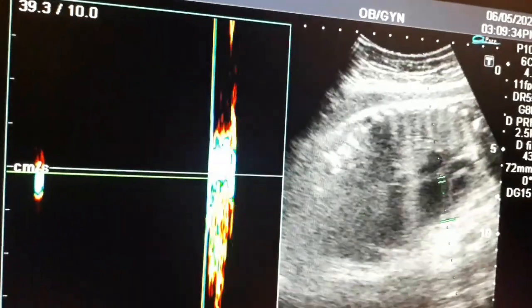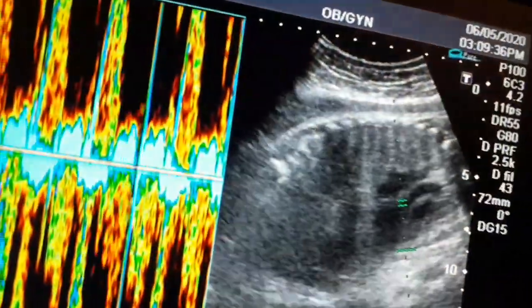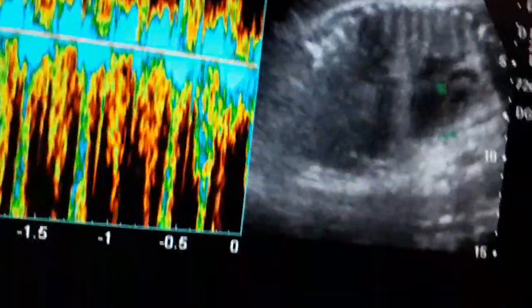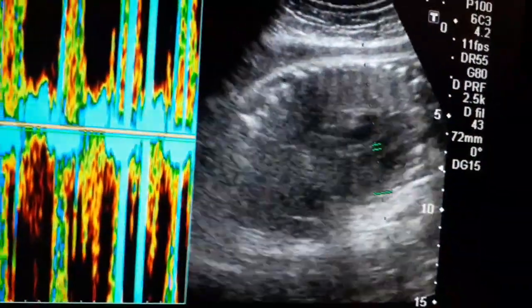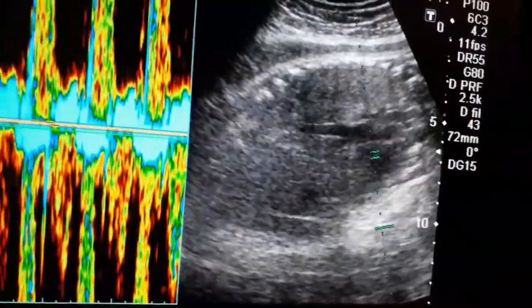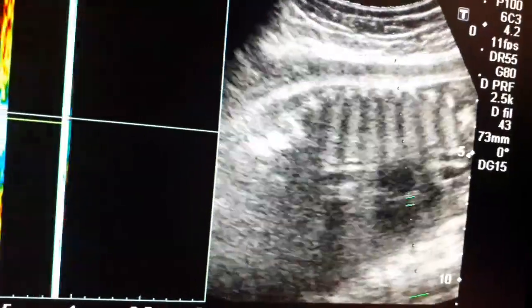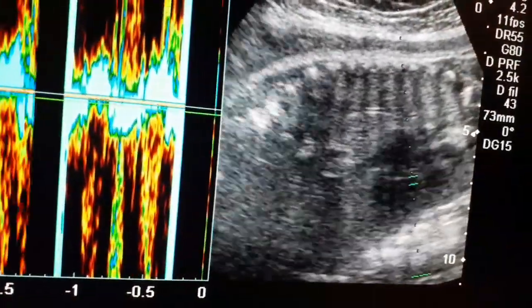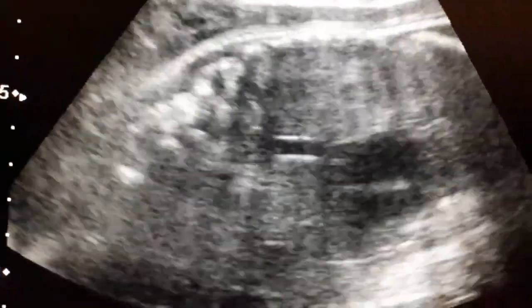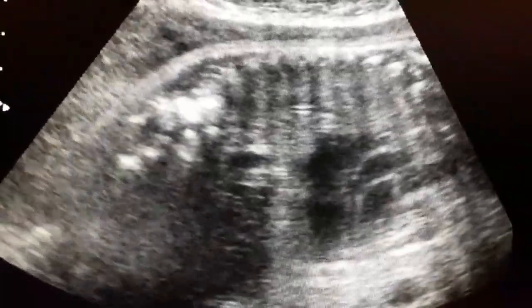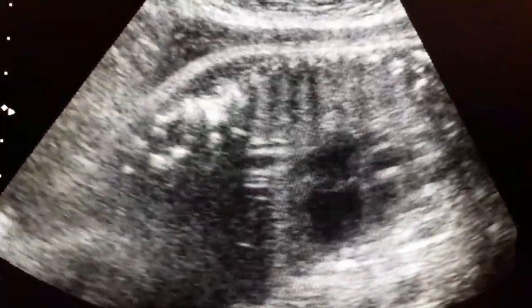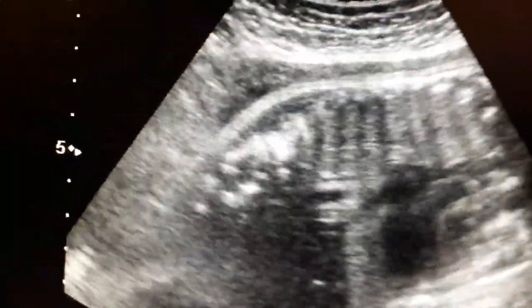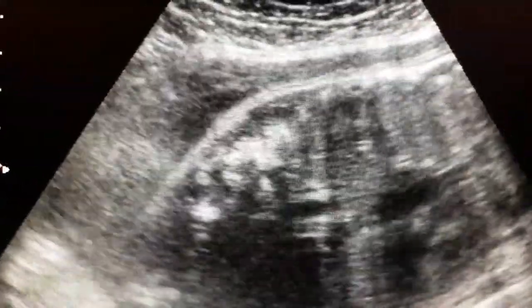To appreciate the heartbeat of the baby, I put the Doppler color into the heart and we listen to the heart sound. This is a close view of the heart — you can appreciate the interventricular septum as well as the atria, giving a very clear view. You can also appreciate the chest and abdominal cavity.